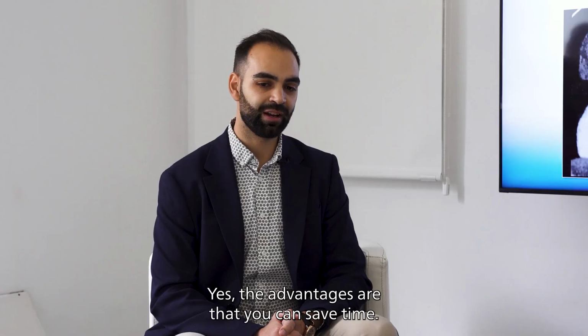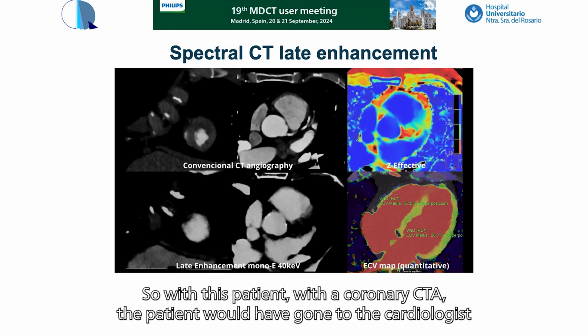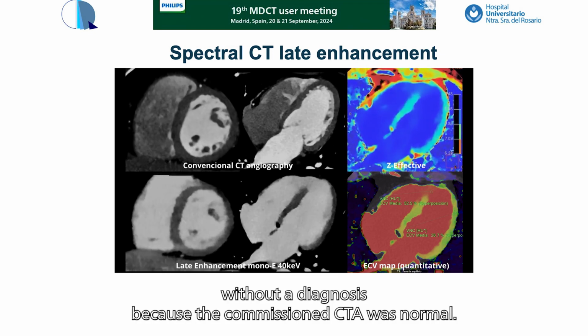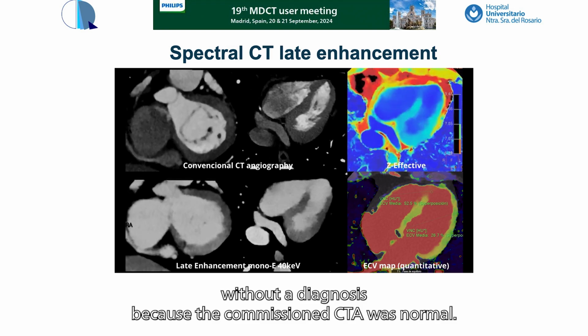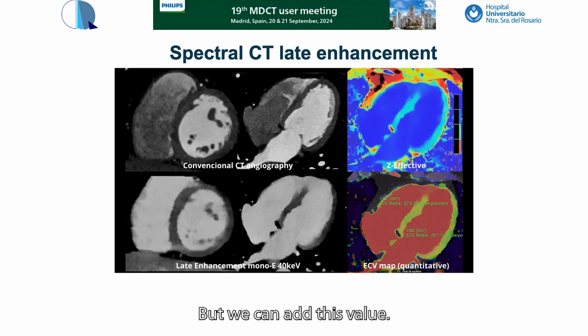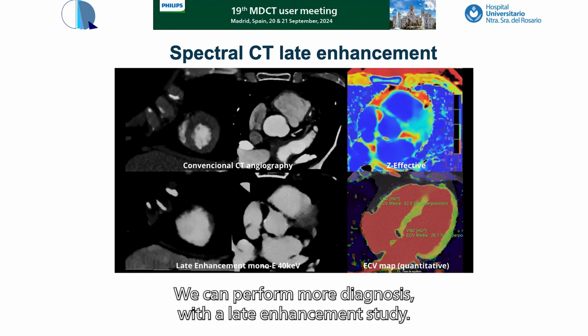Yeah, the advantages are that you can save time. So in this patient with a coronary CTA, the patient would have gone to the cardiologist without a diagnosis, because the conventional CTA was normal. But we can add this value. We can perform more diagnosis with a late enhancement study.